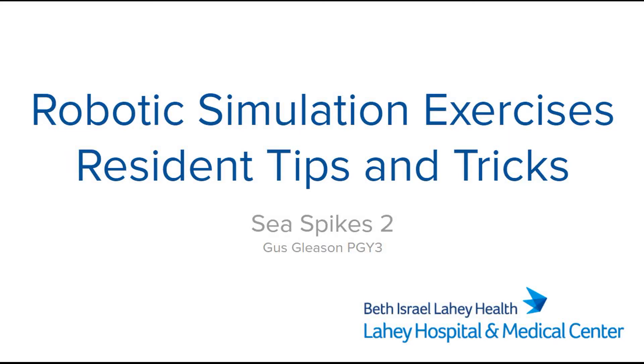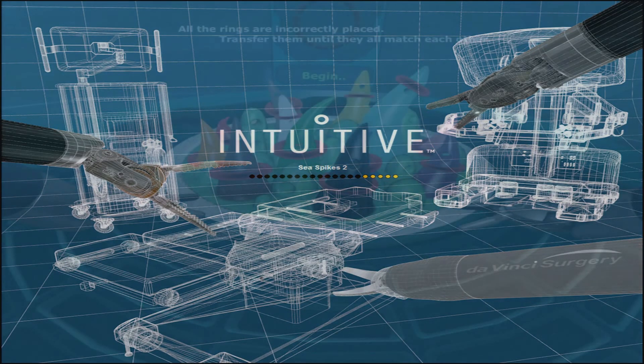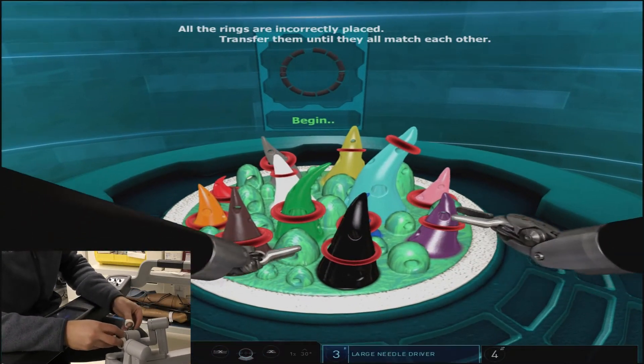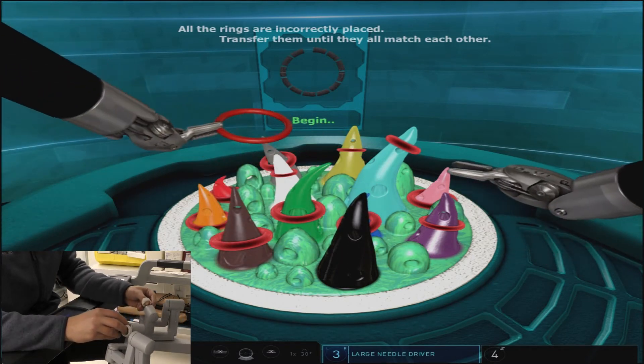C-spikes 2 follows a similar format to C-spikes 1 but now requires a surgeon to remove incorrect rings from the cones and place them on the correct color cone. The ring color and cone orientations change each time you attempt this exercise, so trying to memorize or stick with a pattern is not helpful.